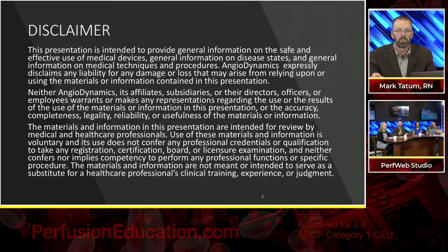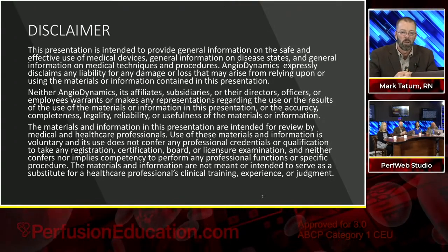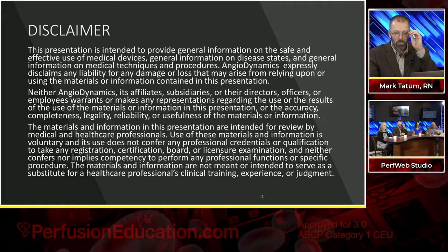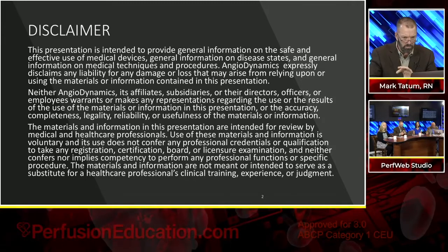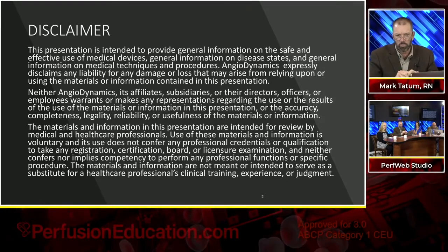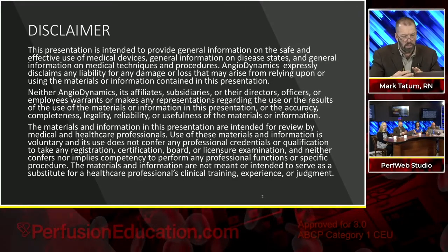I'm going to go ahead and click through a couple of these slides. There is a disclaimer here, and I only bring this up because I'm required to by law. The other reason that I bring it up, though, is that in our indication, there's actually a space in there that talks about the fact that we are contraindicated for use with severe venous or arterial vascular disease, which seems a bit counterintuitive.